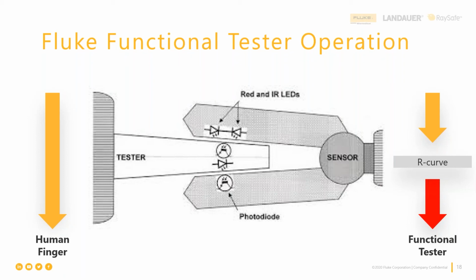This LED has a wide enough bandwidth of light to be detected by the monitor, and there only needs to be one light detector in the monitor that can detect either wavelength, because the monitor knows which wavelength it's outputting, and therefore that is the wavelength it will be detecting at the time.